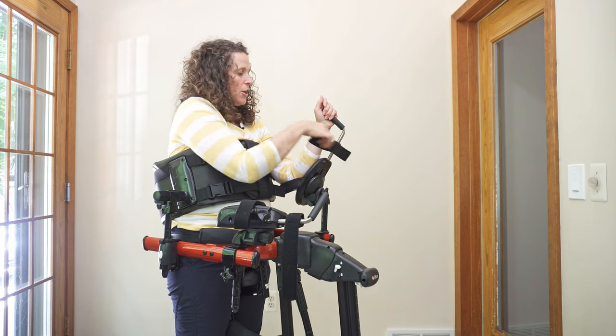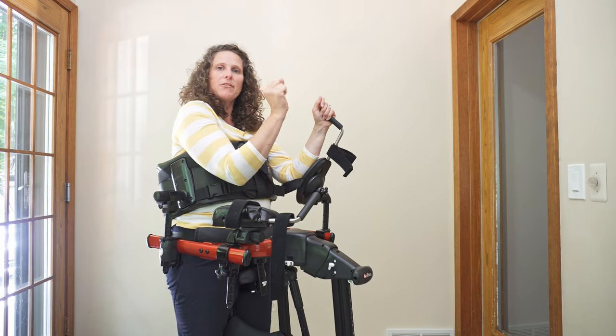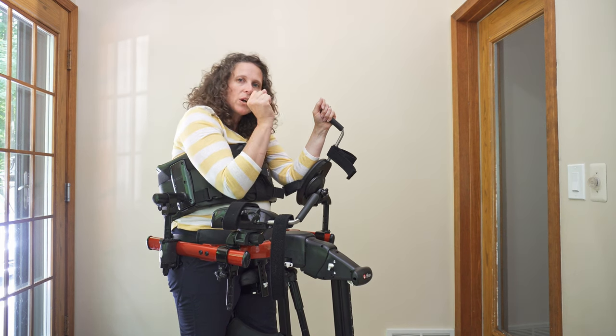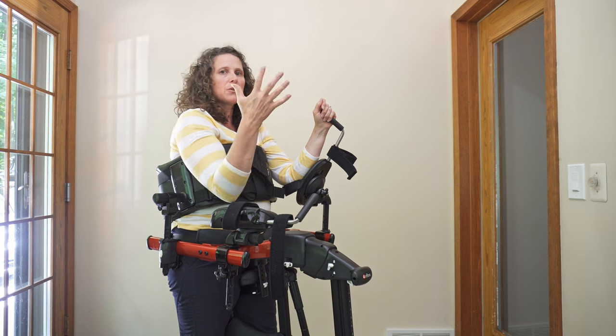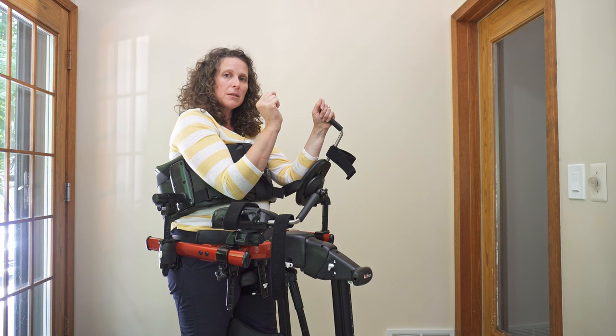The elbow is supported — you may or may not need that strap. But what you can do is have the arms right here, so even if they're forward a little bit, they can work on some active trunk and head extension to lift up and engage with their environment more.